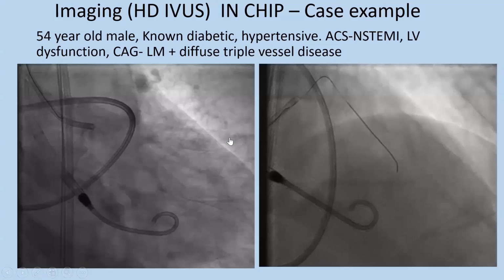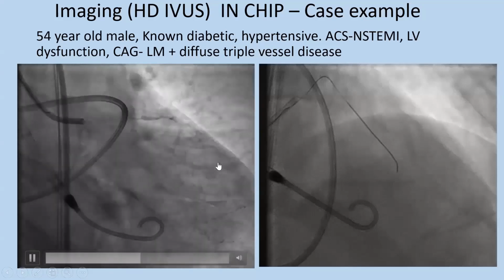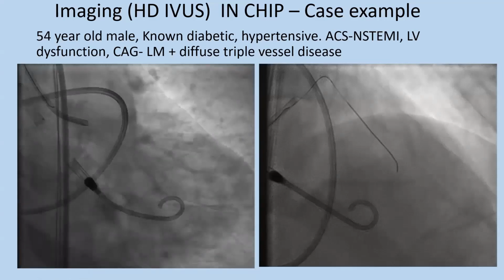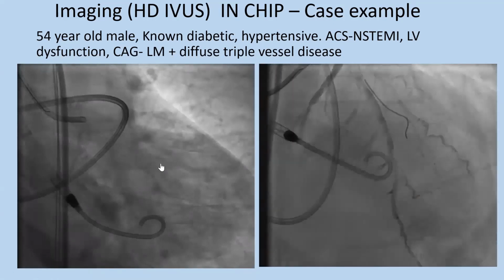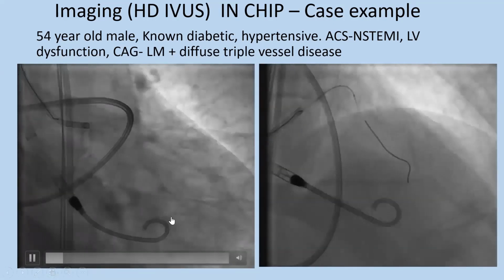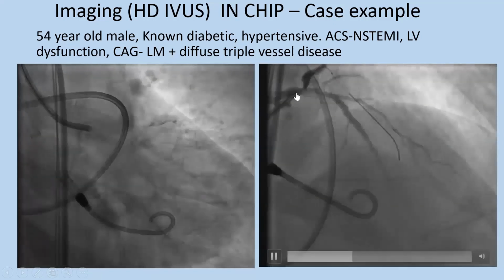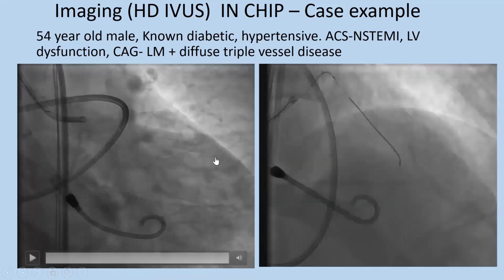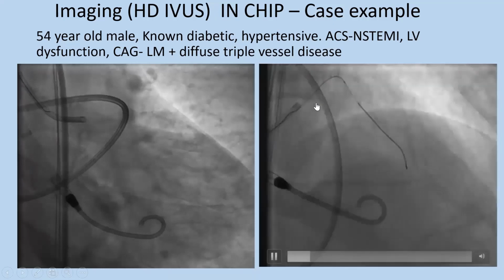So there also is an example of a patient who had come with acute coronary syndrome, a young patient with LV dysfunction, critical triple vessel disease with left main and distal diffuse disease, and a CTO of the circumflex, multiple OM branches. So he had Impella-assisted PCI, with multiple stents to the mid-LAD, distal LAD, OM, and finally left main bifurcation stenting was done.